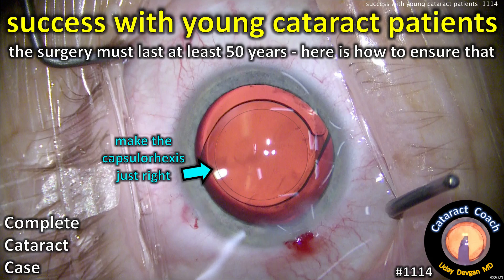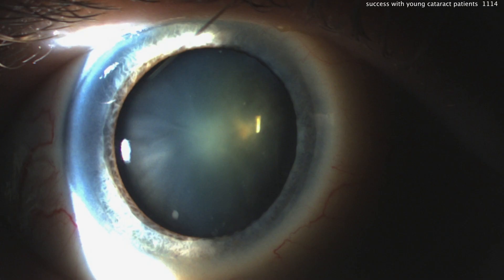CataractCoach.com. Success with young cataract patients — this surgery must last at least 50 years, here's how to ensure that. Preoperatively, looking at this picture, you can see there's a dense central nuclear sclerotic change, and that's causing some visual issues.